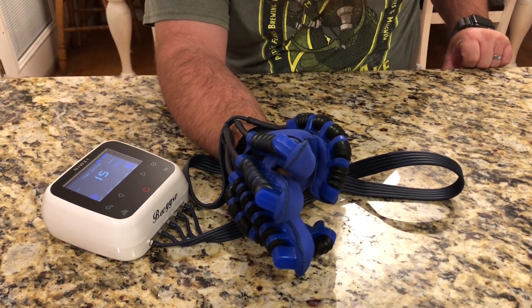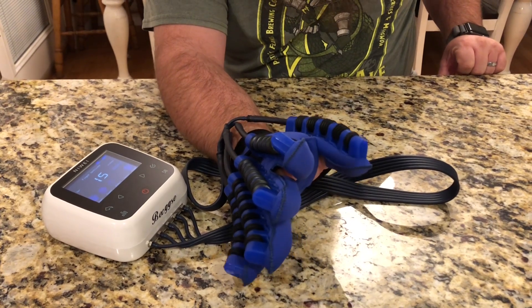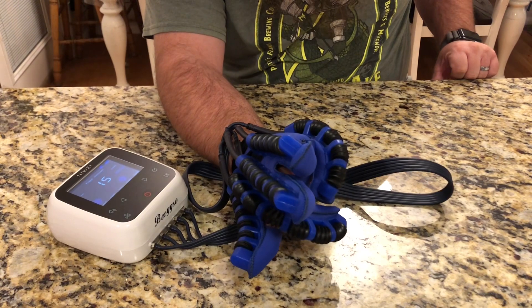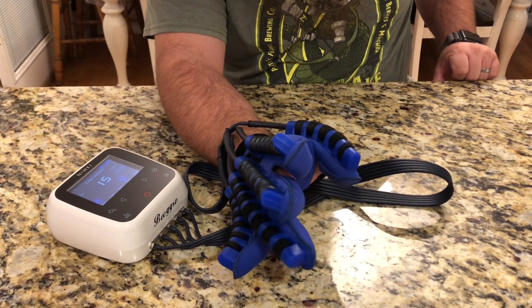It looks like it's going through and squeezing two fingers together in sequence — bringing my thumb and each of my fingers together one at a time.